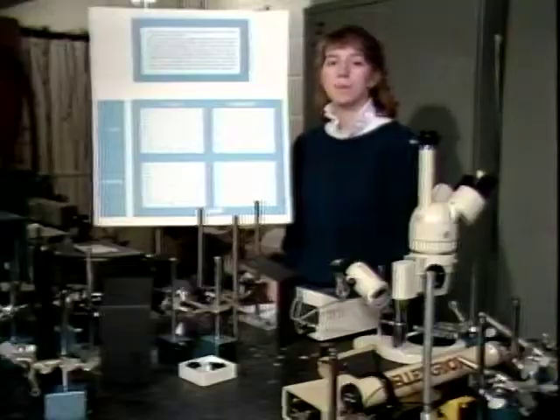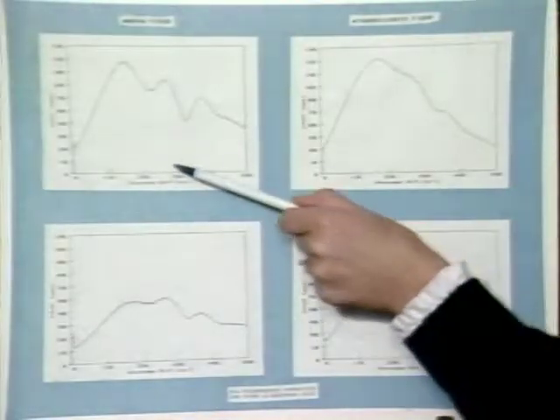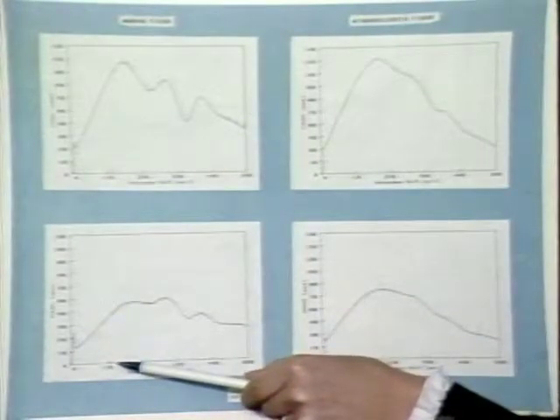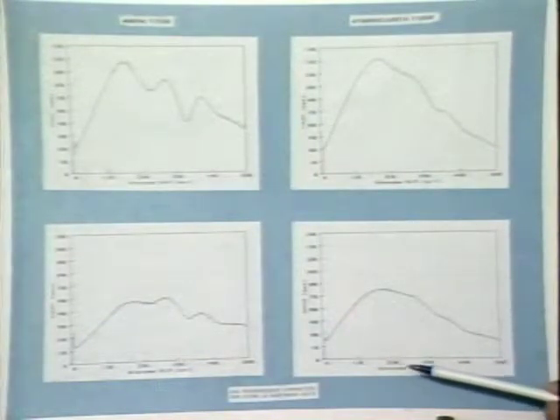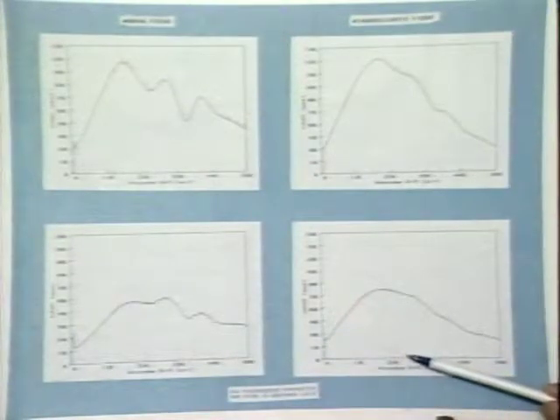One of the problems with this technique is the fact that tissue spectra change after they have been exposed to moderately intense laser light, as in an ablation. The top row shows spectra of normal and atherosclerotic tissue prior to exposure to intense laser light. The bottom row shows the same normal tissue and atherosclerotic tissue spectra after an exposure to intense laser light. Although this exposure was below that required for ablation, spectral differences are dramatic. And the differences between normal and atherosclerotic tissue spectra are very diminished.